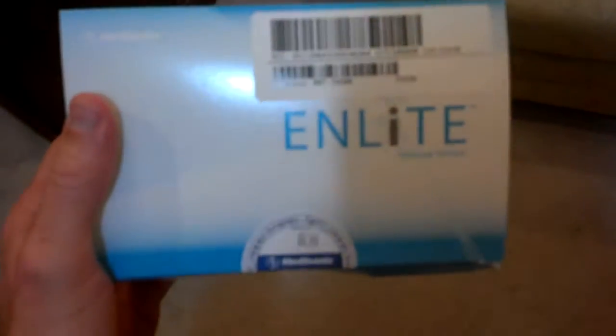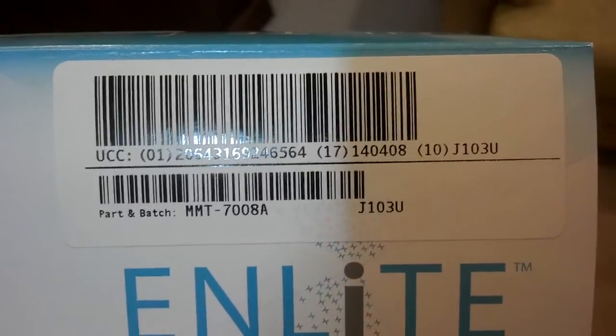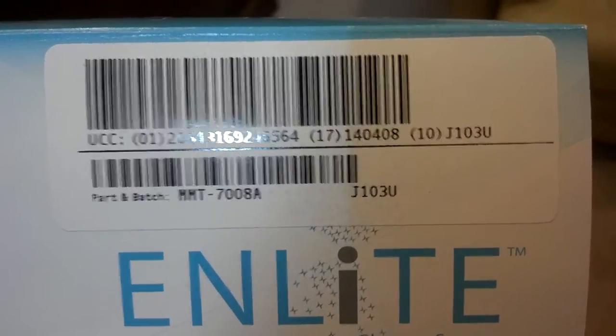This is Neil Moncrief again, continuing my demonstration of my problems with this Enlite glucose sensor. What I'm showing you right now is the box. I'm trying to hold this steady so you can get the batch number and everything that you might need off of this label.